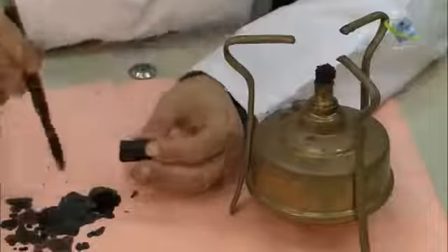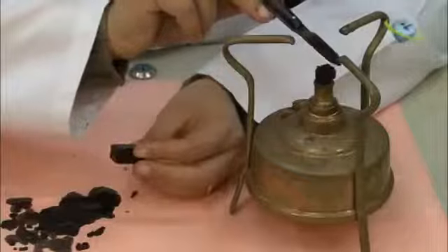We must not reach the line of the drawing while melting.